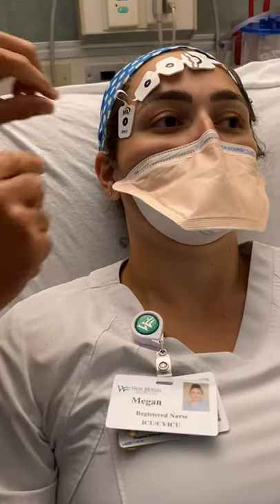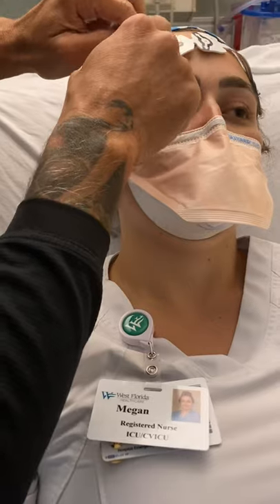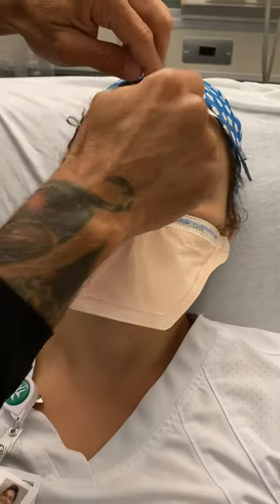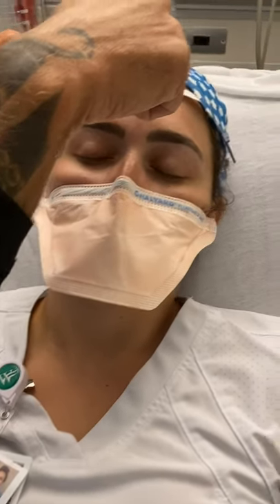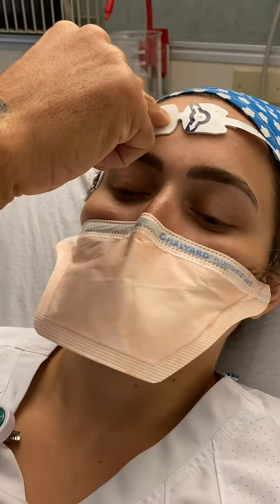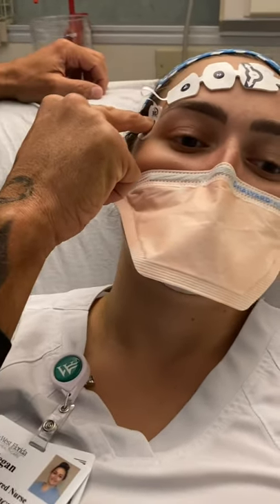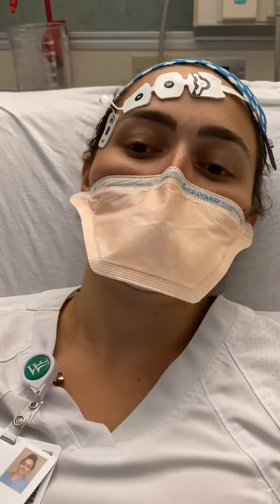After you do that, you push around the lead, not in the center. You don't want to push in the center, because the gel will make it so that the lead cannot stick to the patient. Once it's secure around, then you push for 5 seconds on each dot. 1, 2, 3, 4, 5. And now this is ready.